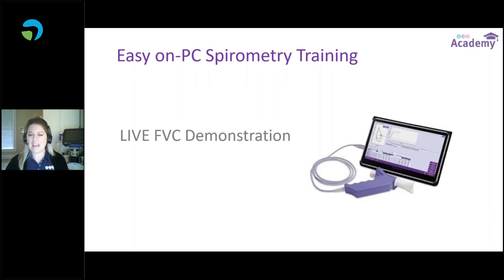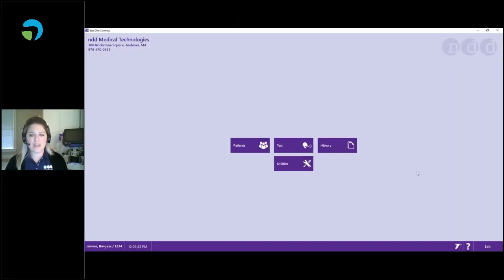All right, I'm going to go ahead and click over to the PC software so you guys can watch along with the software while I'm testing myself. So I am going to switch over. Now you guys should be viewing the EasyOne Connect software. I am going to have my disposables. I'm going to have my Spirette mouthpiece. I'm going to have my nose clips. And then I have my EasyOne PC spirometer. So the Spirette inserts into the spirometer, lining up the arrows. You're going to have your patient sitting.